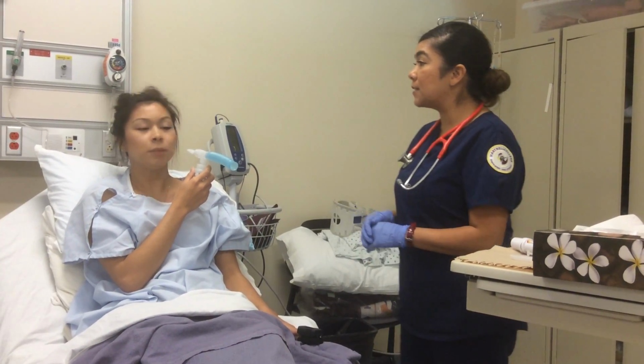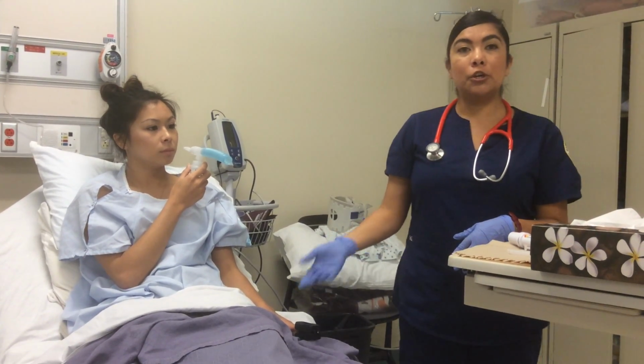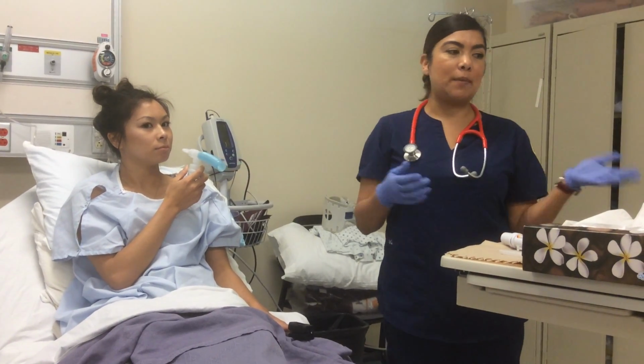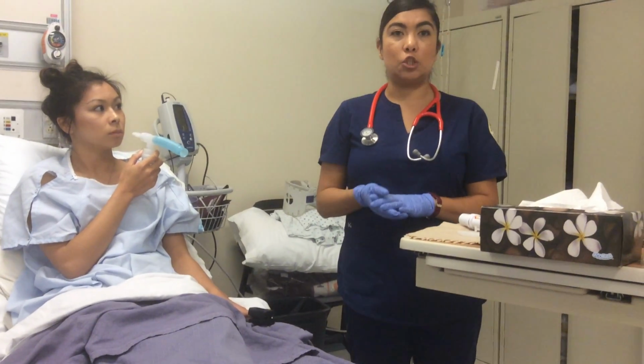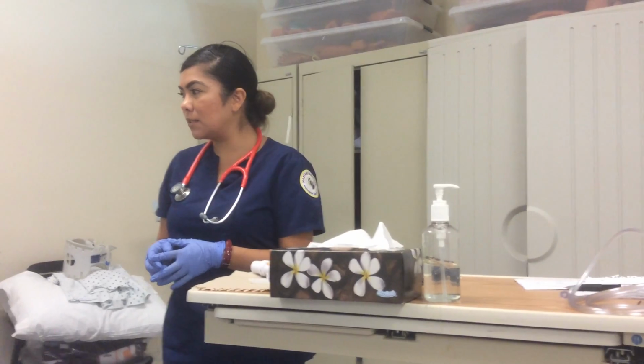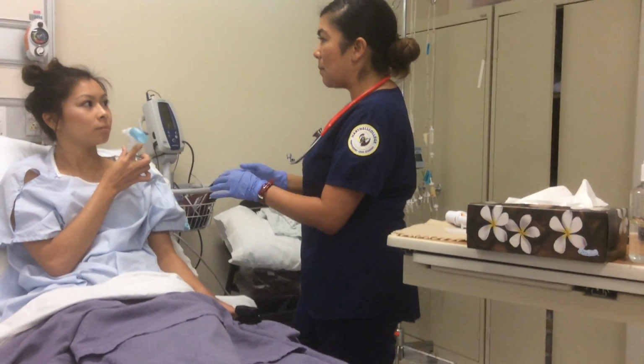Do you have any questions? No. Okay, perfect. So we would just monitor her pulse and then step out and document what we've instructed the patient on and everything, okay? So in this case, we'll just say that the 15 minutes have already passed, okay? So Ms. Adeno, looks like you're done with your medication, okay?